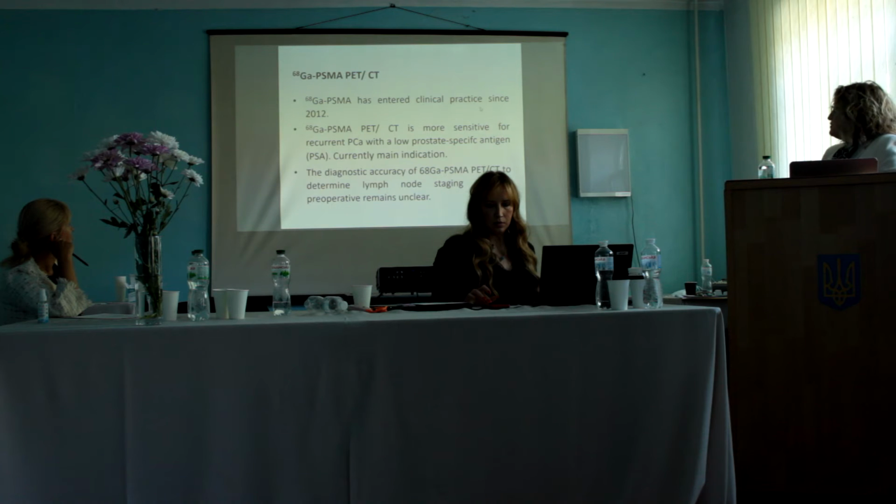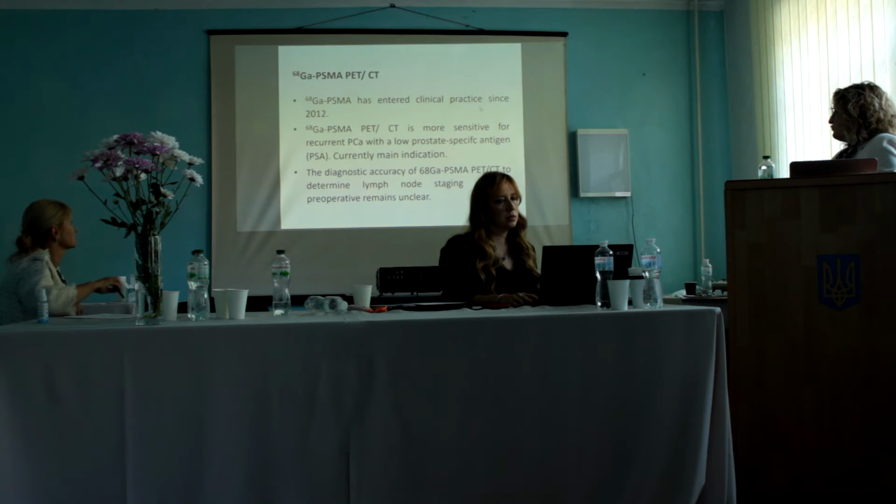Gallium-68 PSMA has entered clinical practice since 2012, and it is more sensitive for recurrent prostate cancer with a low prostate-specific antigen level. Recurrent prostate cancer is a main indication for gallium-68 PSMA PET-CT application. The diagnostic accuracy of gallium-68 PSMA PET to determine preoperative lymph node staging of prostate cancer remains unclear.